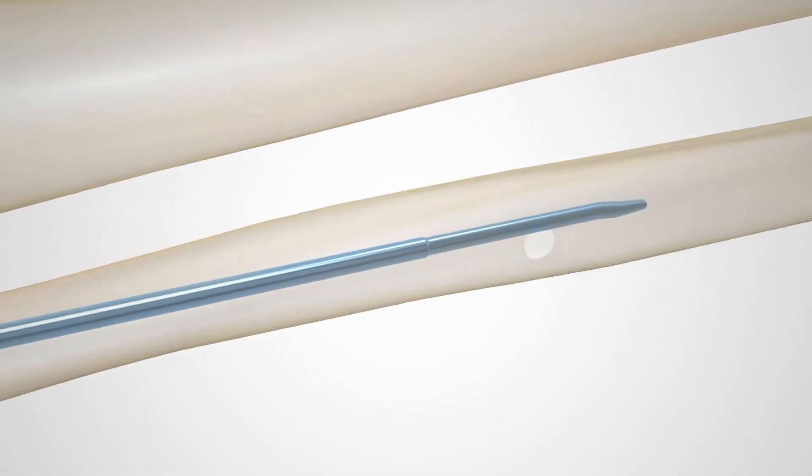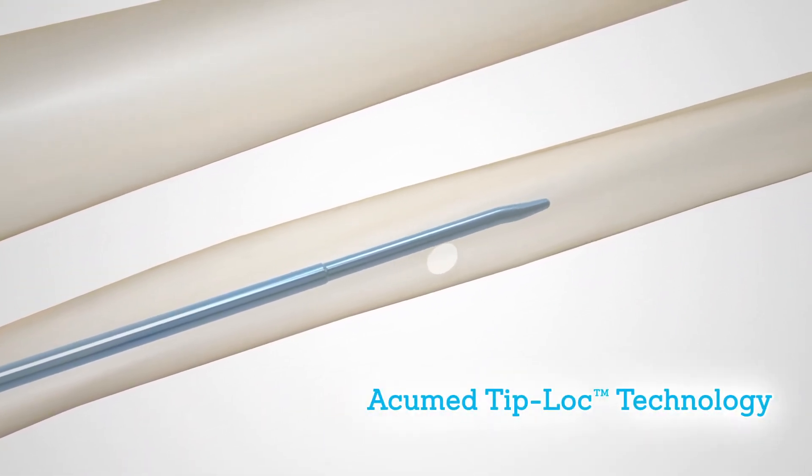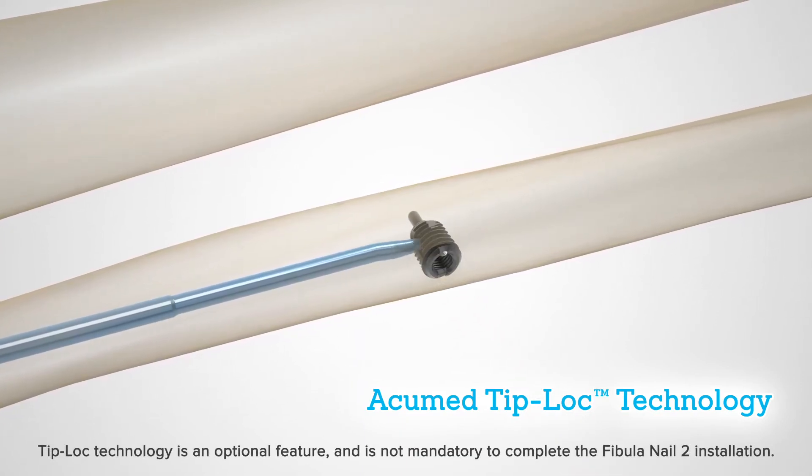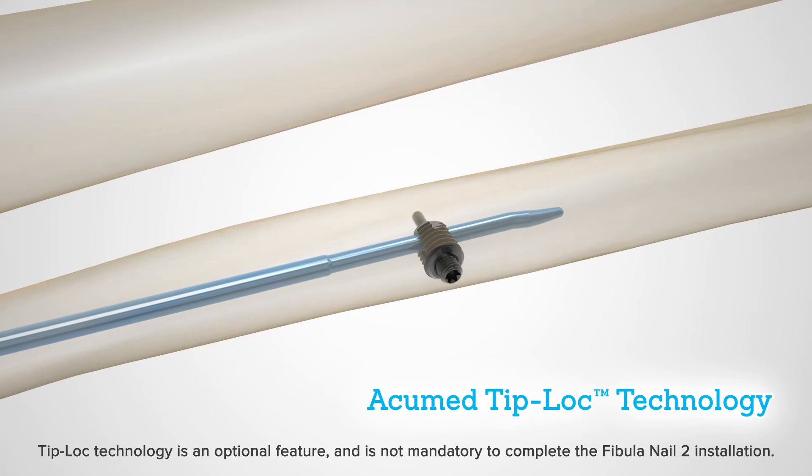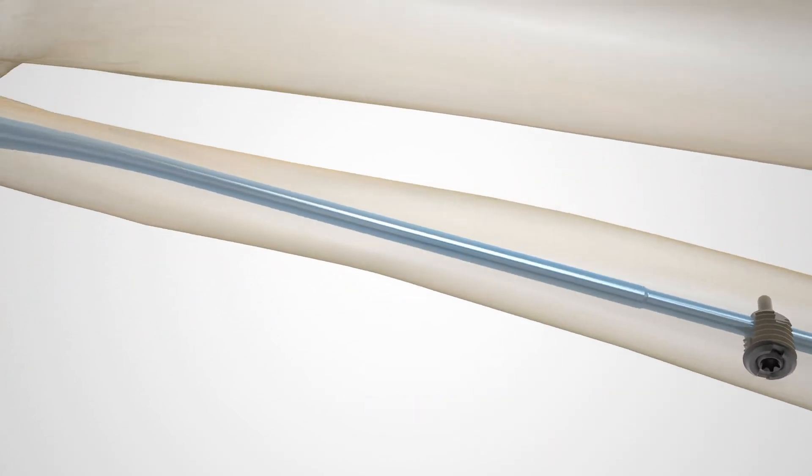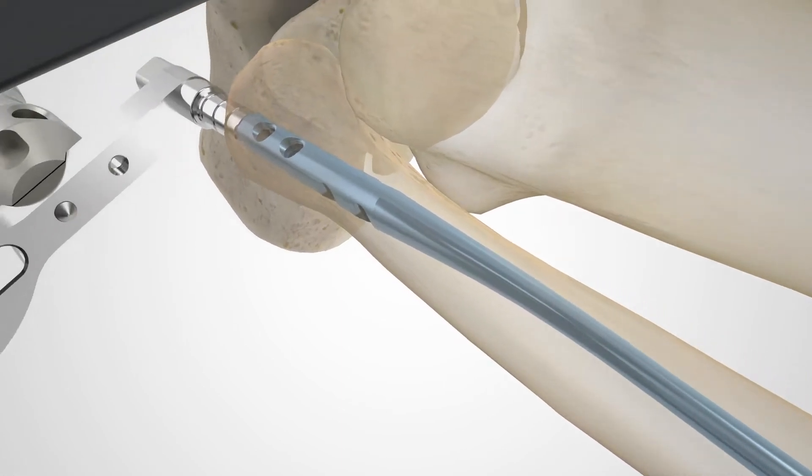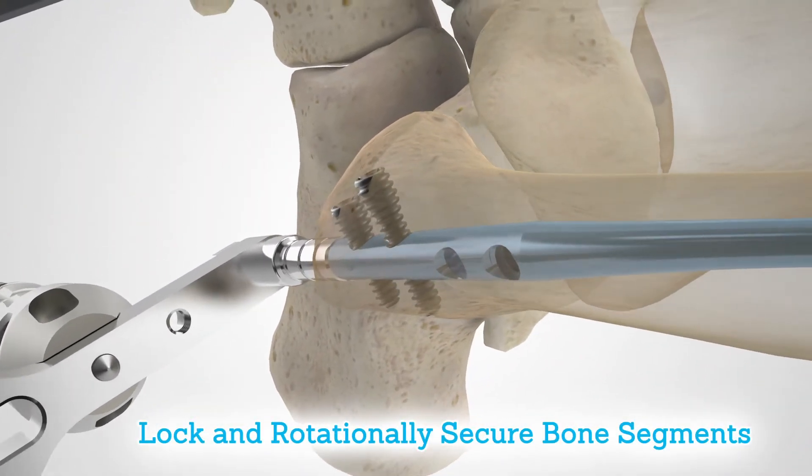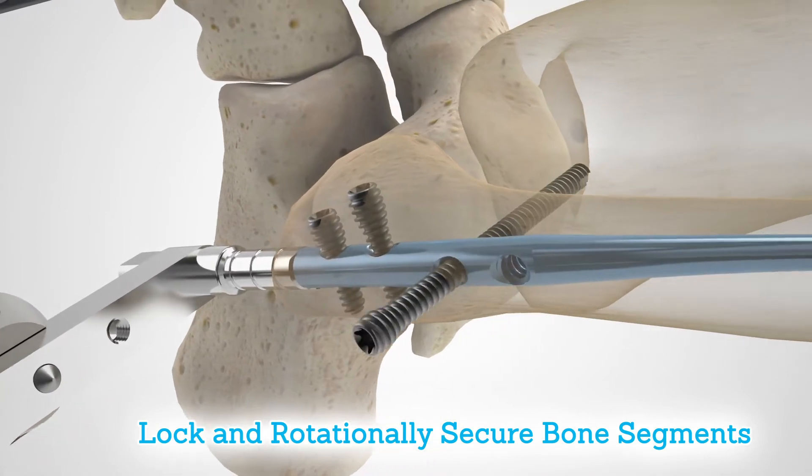Acumed's tip lock technology has been implemented as an option in both the fibula and ulna nails of this system. This technology offers the option of a set screw and bushing at the proximal end of the fibula nail. This combination and additional screws at the distal end of the nail help lock and rotationally secure bone segments to assist in fracture union.